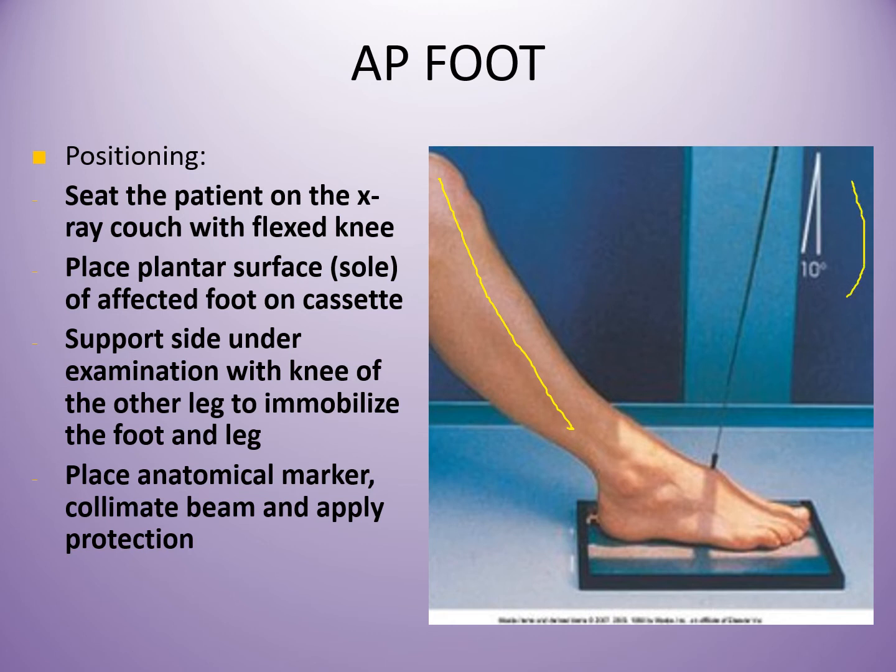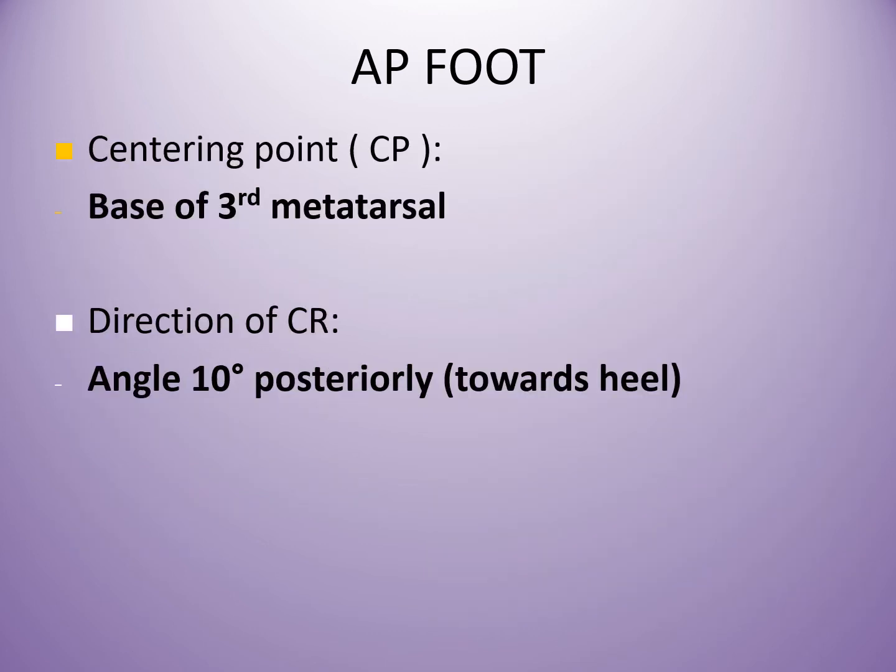Okay, you can see there is angulation here due to the anatomy appearance. You have to angle the tube a bit, entering point at the third metatarsal. Then you angle posterior towards the heel.